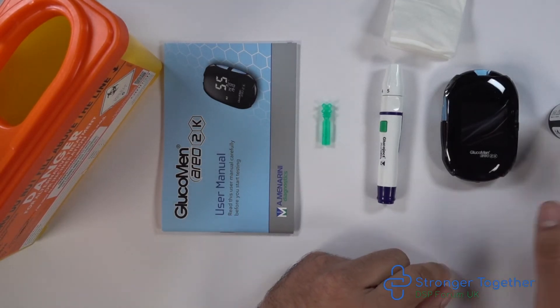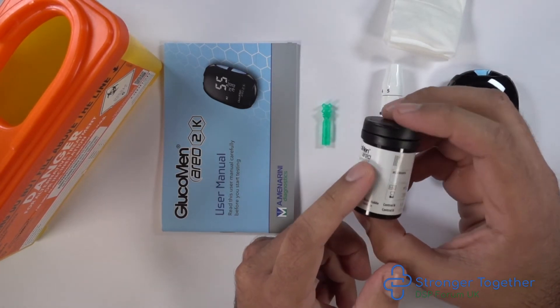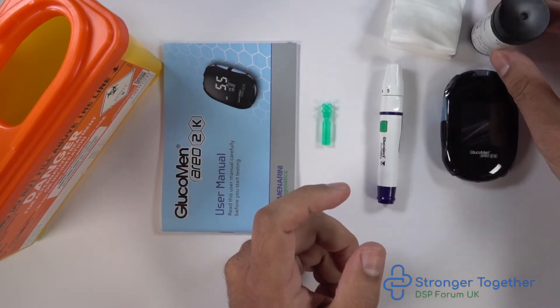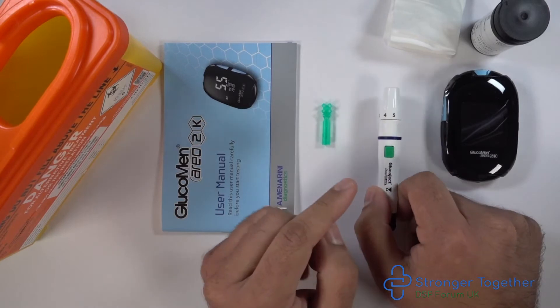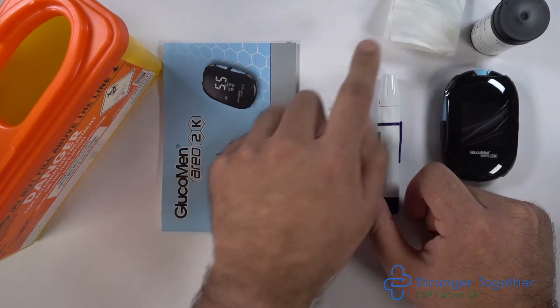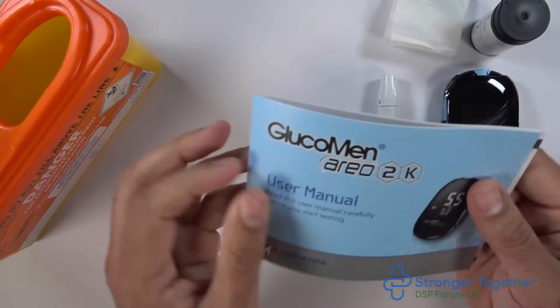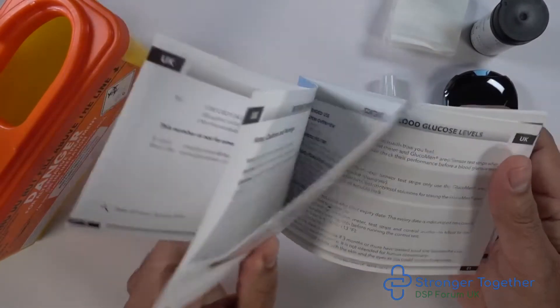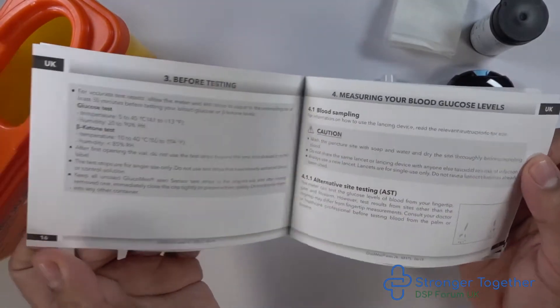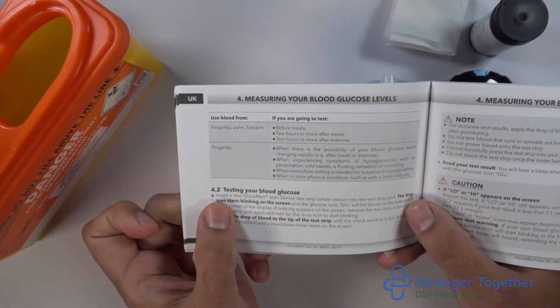First of all, check the test strips are for your machine — in this case the Glucomen REO2K device — and check the expiry date. Here we have our Glucoject dual lancing device and the lancet, our instruction manual, our tissue, and our sharps box. If you flip to the section for measuring your blood glucose levels, you can see there are detailed instructions in that manual, so please refer to that if you need any further help.